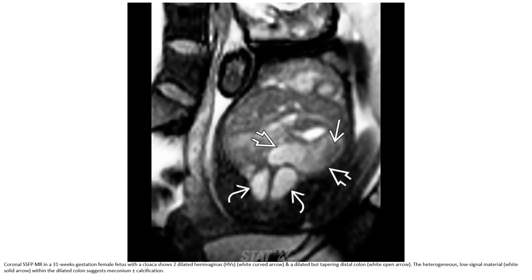This is an SSFP MRI in a 31-weeks gestation female fetus with cloaca malformation, showing two dilated fluid-filled structures and a dilated but tapering distal colon. There is a heterogeneous low signal material within the distal dilated colon, consistent with meconium plus or minus calcification.